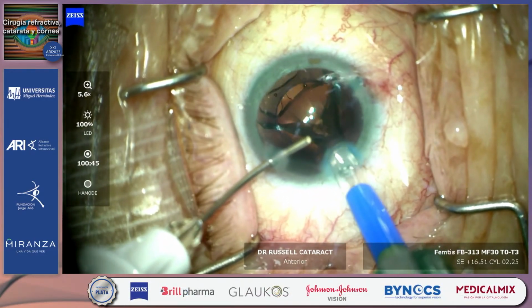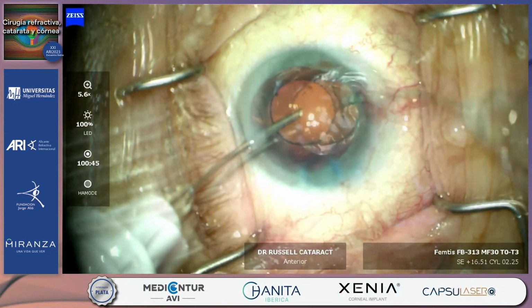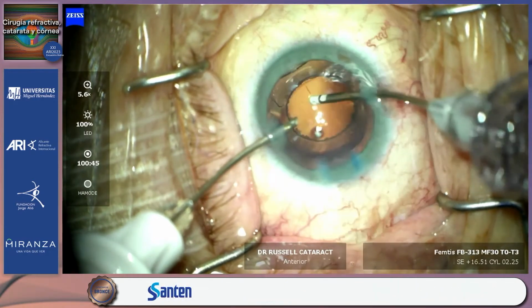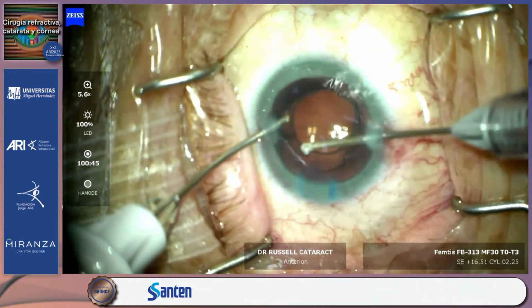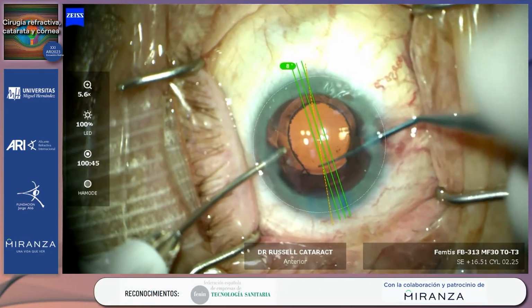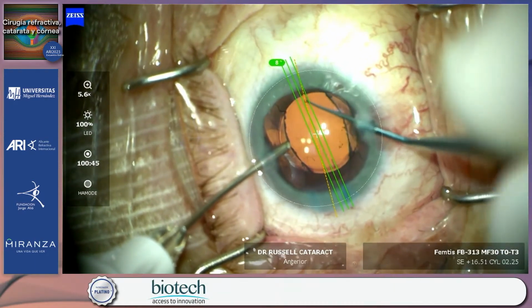The Femtis IOL is injected with a one-handed technique directly into the capsular bag without any additional viscoelastic. The irrigation cannula is being used as an AC maintainer. There are no endothelial concerns here because the IOL never is near the posterior cornea. At this point, I'm positioning the implant optic into the capsulotomy, a technique called enclavation.